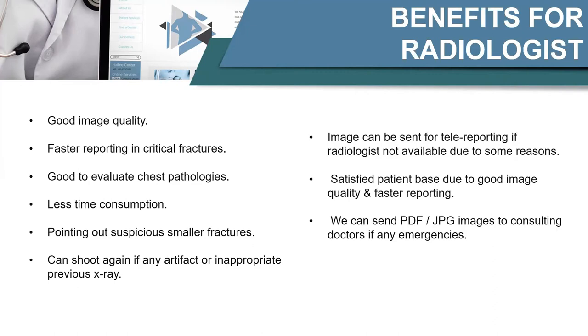Image can be stored in the data, and then we can send it for telereporting also. So if at all the radiologist is not present at the center, then it can be sent in PDF or JPG format to the radiologist, and he can report remotely. Next slide, please.